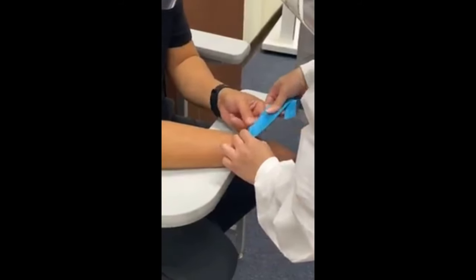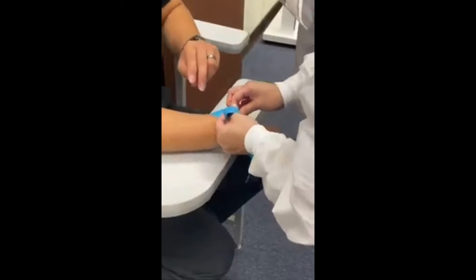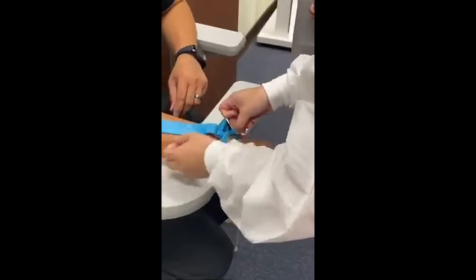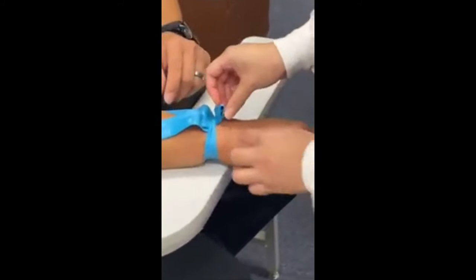Yeah, so this one here on the bottom will go over. Go over, yeah. So this one could just drop, and this one, there you go. Just like that. There you go. Bunny ears. There you go, yeah. Okay. So yeah, this one side there, perfect. Okay, that's good. Good tension.